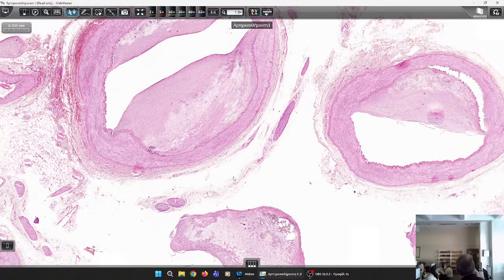Yeah. So the endothelium that forms above the fibrous layer of the plaque, is it functioning normally? No, there is always a dysfunction in the endothelium when an atheromatous plaque is formed. However, in order that there is an acute phenomenon and that causes the thrombus, this endothelium should be eroded. So it's like an ulceration of the endothelium. So if there is an ulceration or an erosion, a microhemorrhage may occur, and so it will cause thrombosis.